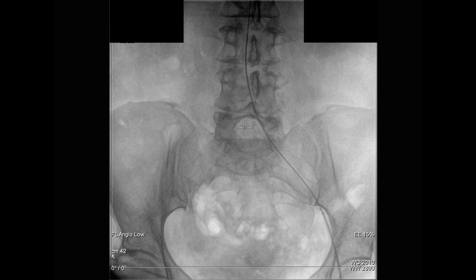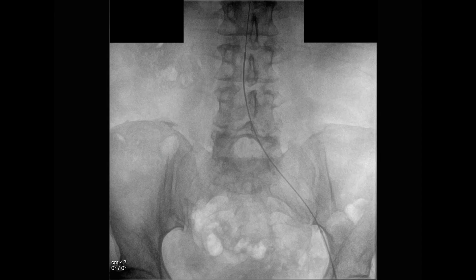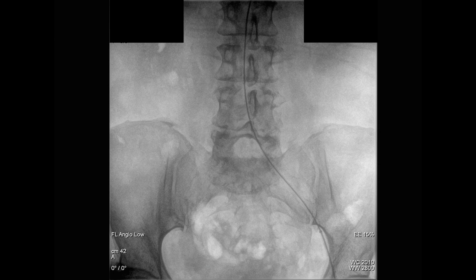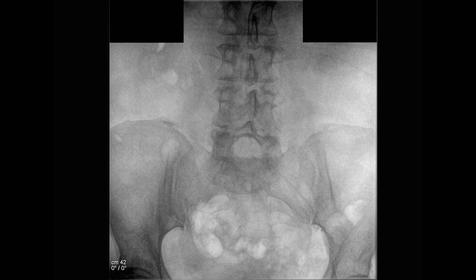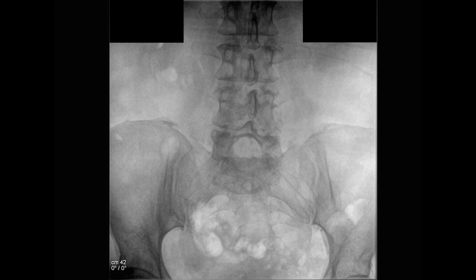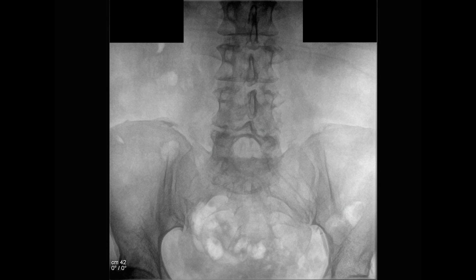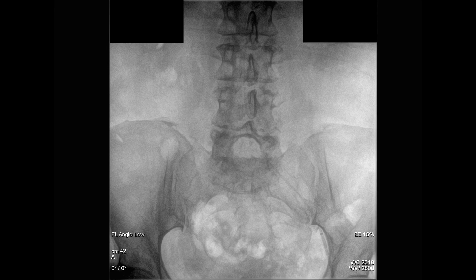We used a cobra catheter for our abdominal aortogram and pelvic angiogram. The catheter was formed in the abdominal aorta and was placed roughly at the level of the L3 vertebrae to perform our abdominal aortogram and pelvic angiogram, as demonstrated here.